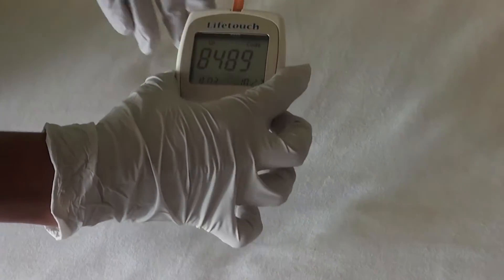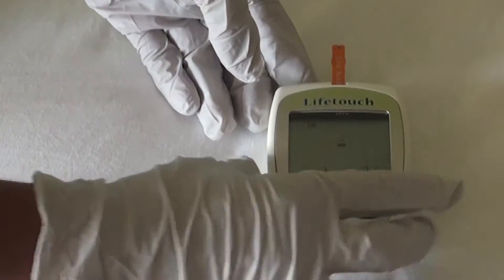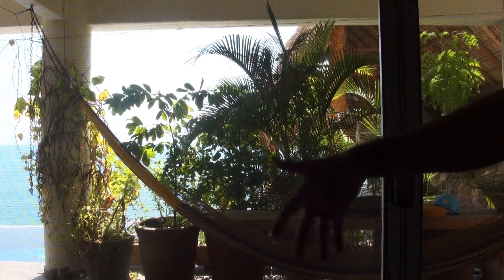Put the strip in the unit — it will go on automatically. The screen asks for a blood drop. Shake your hand to get extra blood flow.